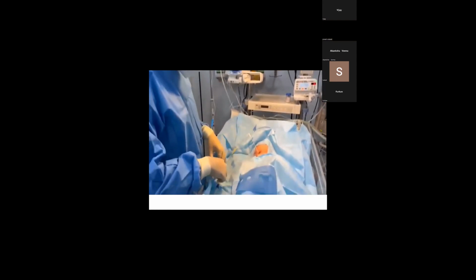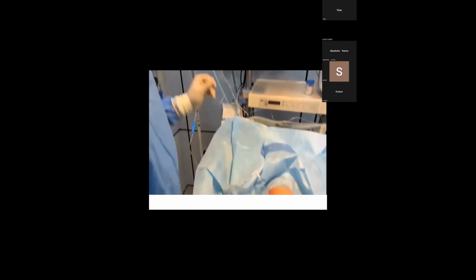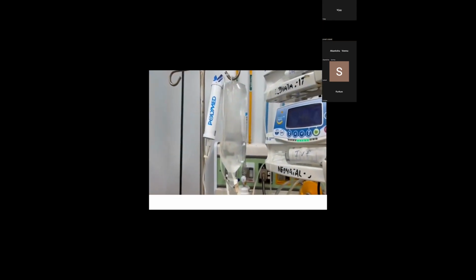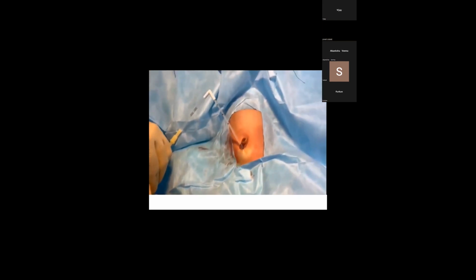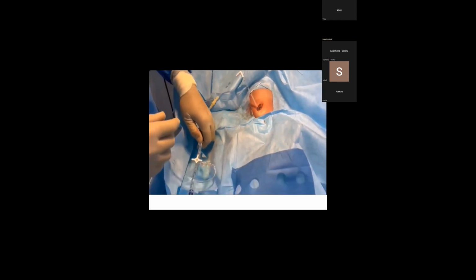Then we have to check the adequacy and competency of the peritoneal dialysis catheter. For this, we open the tri-way of the inflow circuit, and then instill dialysate fluid, first in a small amount, 5 to 10 ml per kg, into the peritoneal cavity. After the dwell time, we open the outflow circuit and check the fluid coming out through the drain into the urobag. So this completes one cycle of peritoneal dialysis.